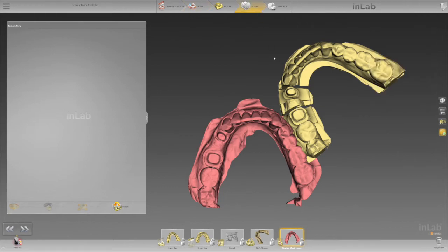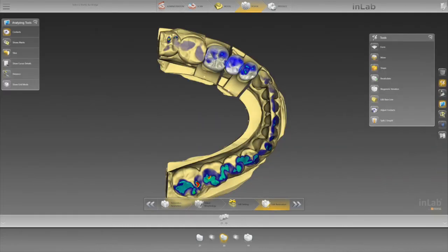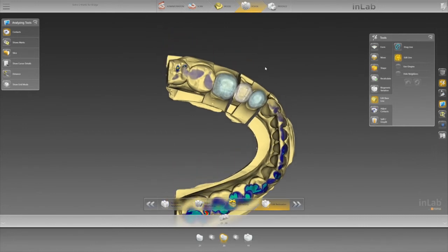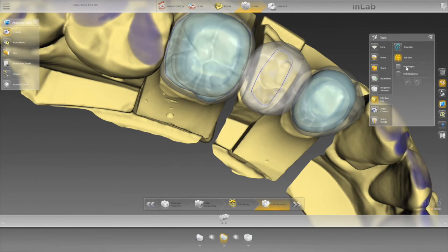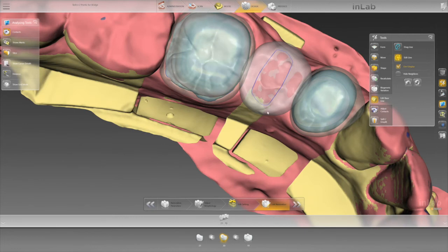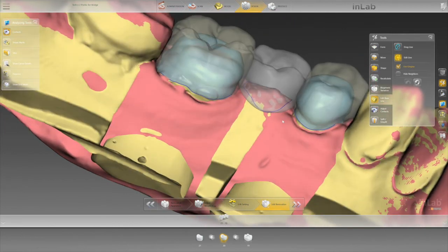So if we jump back over to our design phase and go to edit our baseline, we now have a tool that says 'use gingiva.' Click on use gingiva, then you can draw your pontic baseline over on the gingiva right up to your neighboring tooth if need be, and it will now propose it there.